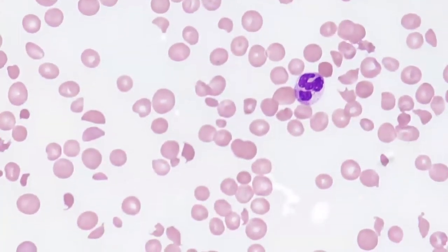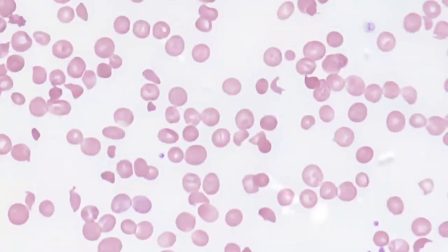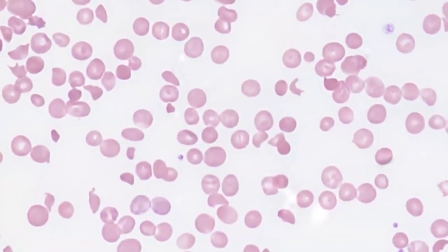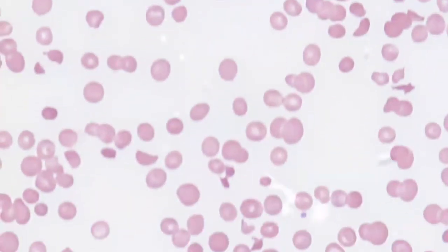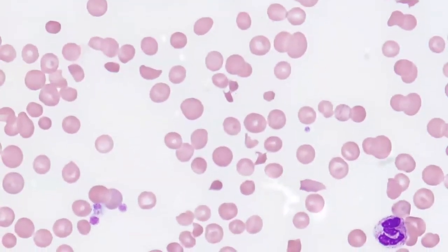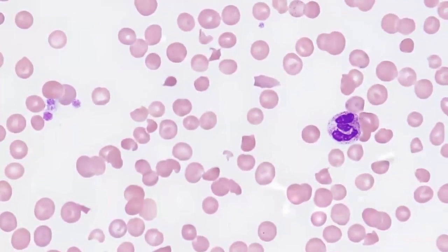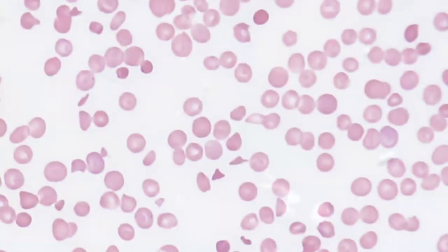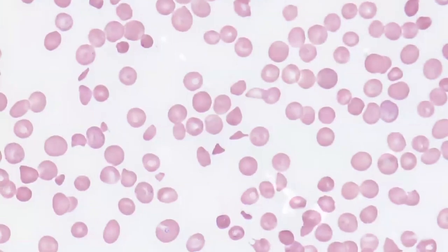Schistocyte technically is defined as any red cell fragment. However, it is difficult sometimes on morphology alone to identify a red cell fragment from, for example, a bite cell. And so when you see a red cell with 3 distinct points, you can definitively identify that as a schistocyte. And in this case of microangiopathic hemolytic anemia, we see numerous schistocytes. Here's another really good example of a triangular form of a schistocyte.